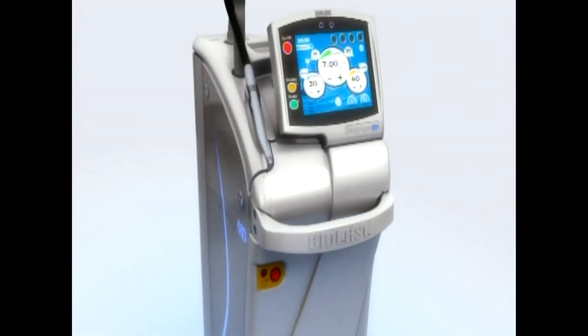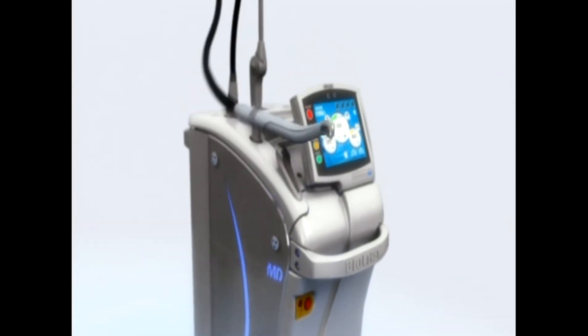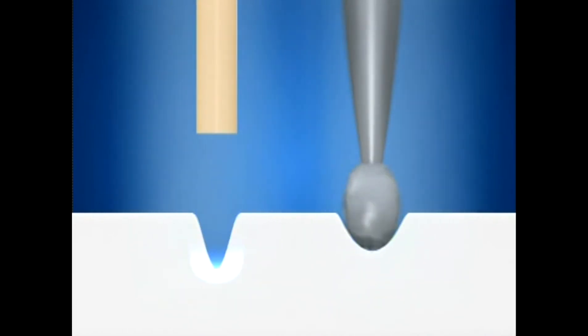The MD Gold handpiece is closer in technique to what you're used to from many years of high-speed drill experience. Although it may be similar, the MD Gold is not the same as the burr where you contact the tooth and apply pressure to cut. The MD Gold tip should be 1 to 2 millimeters from the tooth surface and requires no pressure or contact to cut. Brief contact to tissue is not a problem as long as it's quickly removed from the surface.